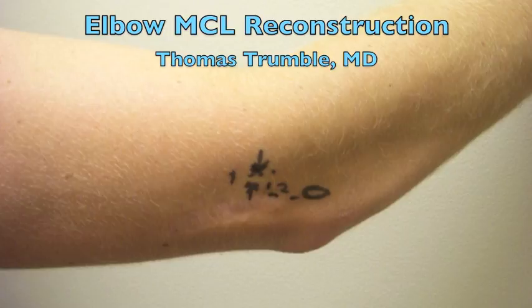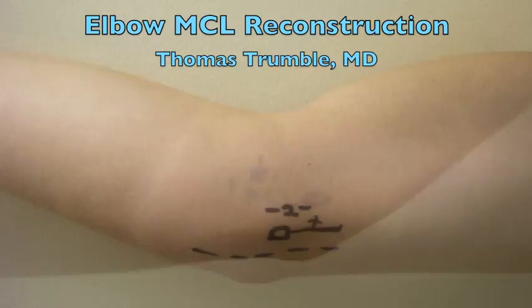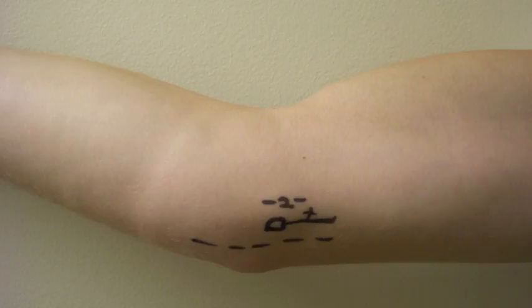This is first approached arthroscopically with a proximal anterolateral portal, 2 centimeters proximal to the lateral epicondyle and 1 centimeter anterior, and a proximal anteromedial portal, 2 centimeters proximal to the medial epicondyle and just anterior to the intermuscular septum.